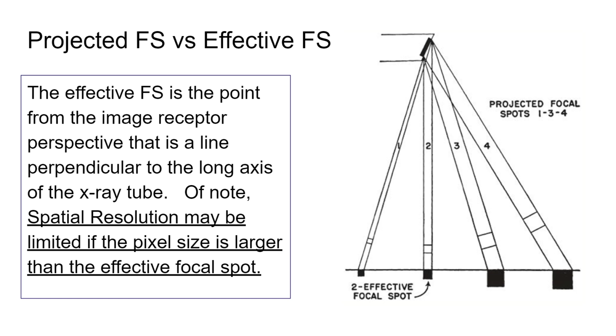Pixels should never be larger. That's also why radiologists have so many pixels on their monitors, right? Yeah, they have really, really expensive monitors. We'll learn some of these terms next semester. If you think we talk digital this semester, just wait. But we'll get into things like dot pitch, which is the space between pixels, the center of one pixel to the center of the next pixel. What is that? Well, now you know it's a dot pitch. That's not on the test though. Next year.